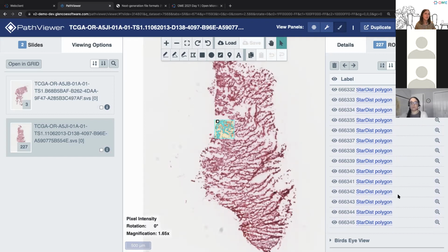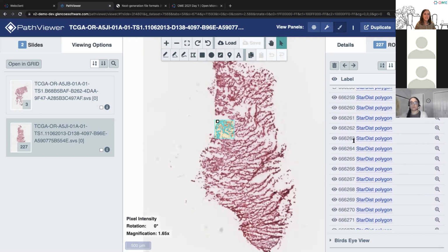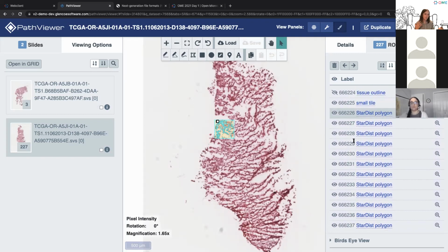Of course that could be changed, but it just emphasizes the paired challenges where I have many objects which I want to be able to interrogate individually, but they're not really individual objects. They represent a single segmentation run that should be viewed and analyzed in one piece, rather than a big long list of individual cells in an isolated manner.